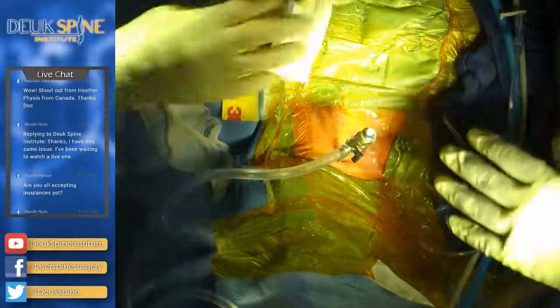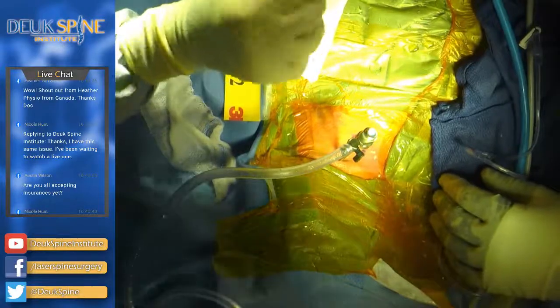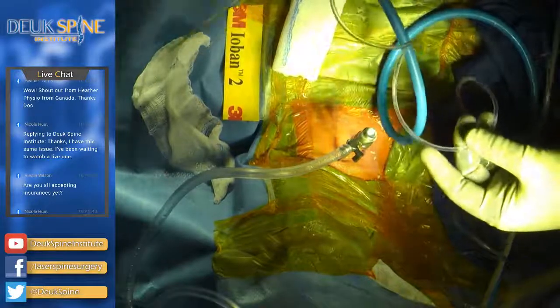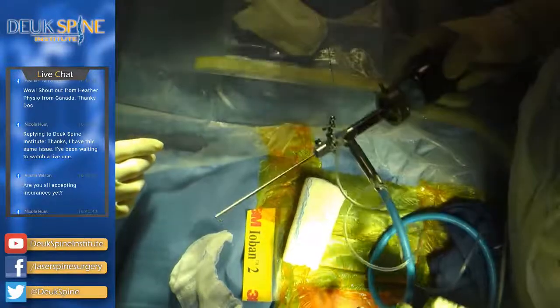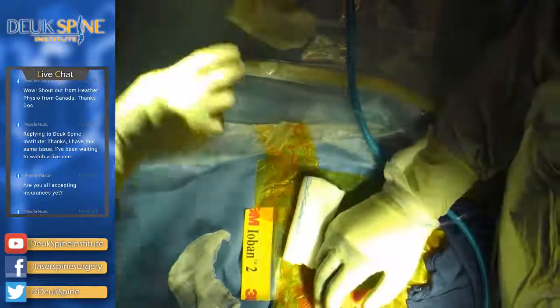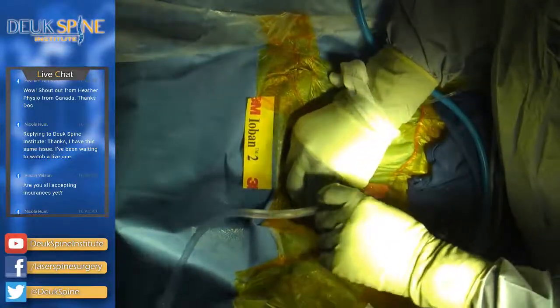Okay. So let me just show everybody, and there's some herniation right here. Okay, like right there. Want to grab it? Let's show everybody what we're doing here. We got the rig here. We call it the endoscopic rig. Irrigation, light source, camera, endoscope, laser fiber, and then we even have suction on the tube here. And I go down this little tube and this little hole to the back of the disc, and basically that's what we did to fix the herniation and repair it.